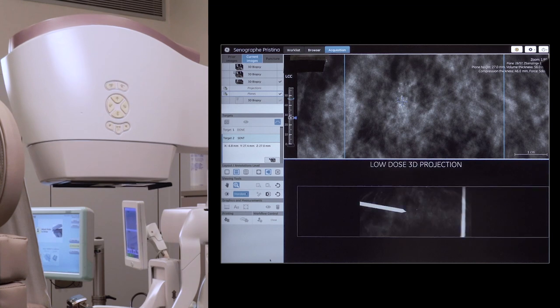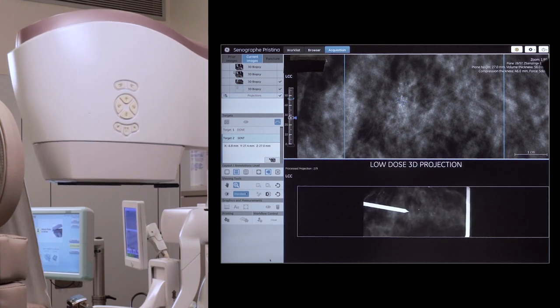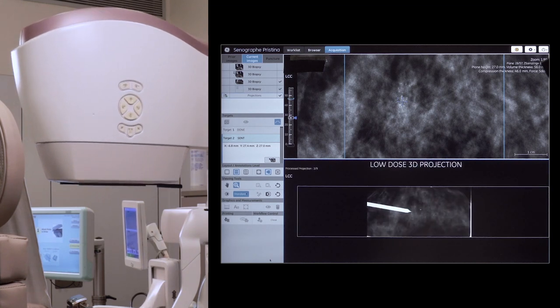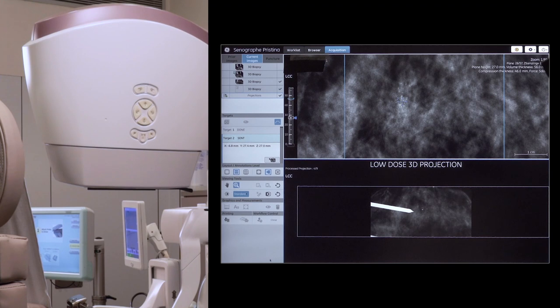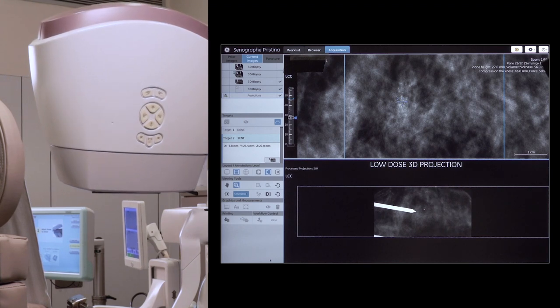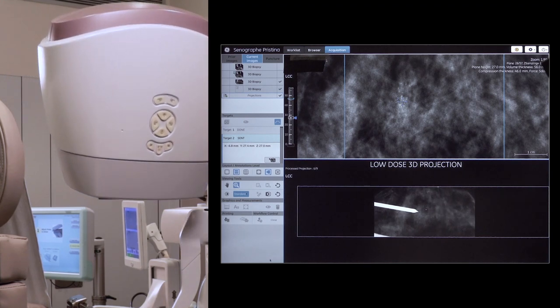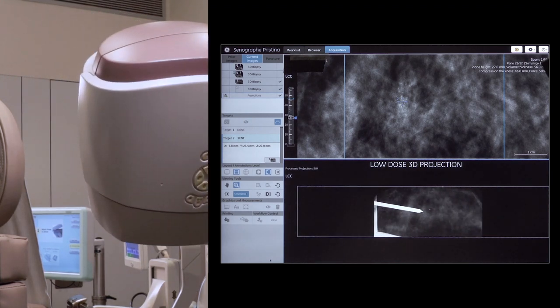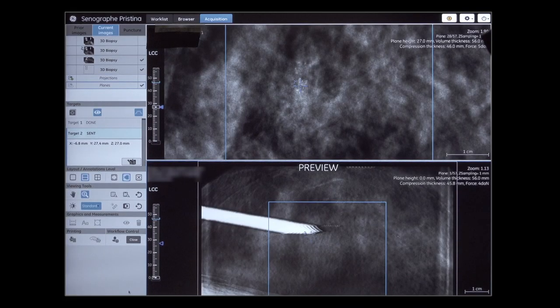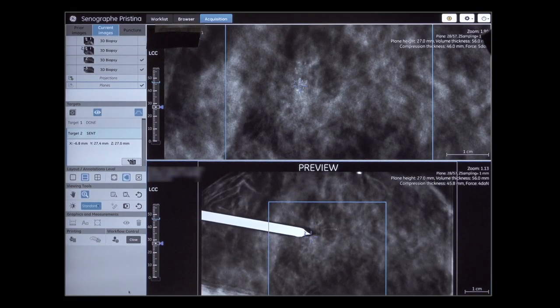A 3D biopsy sequence is taken to check that the needle tip is approaching the lesion as per the pre-fire position. Once the needle tip, target, and lesion are aligned, the N-Core can be fired.